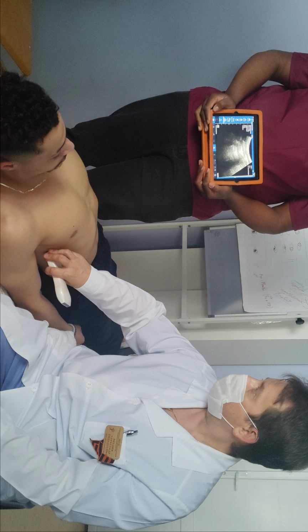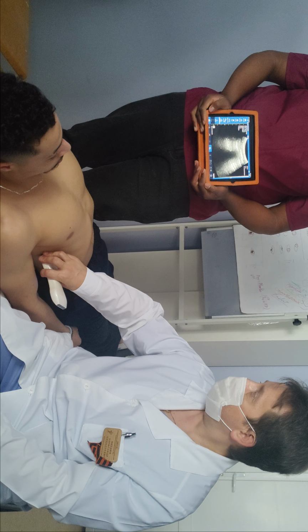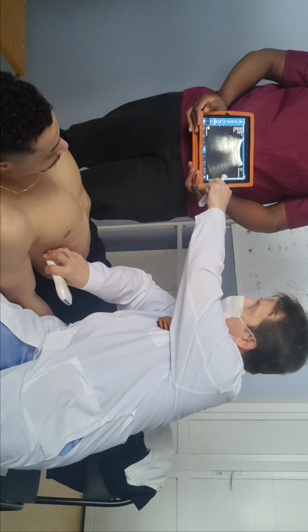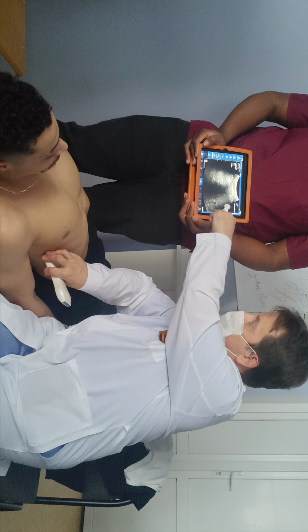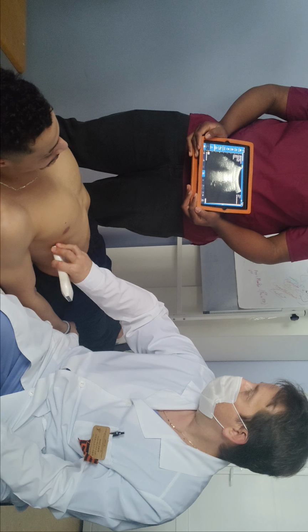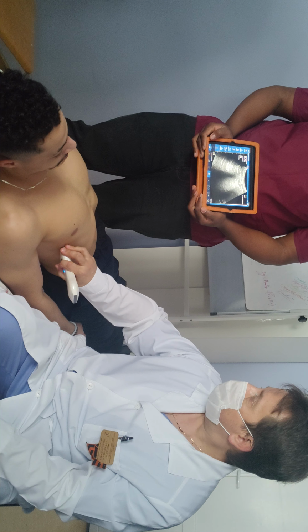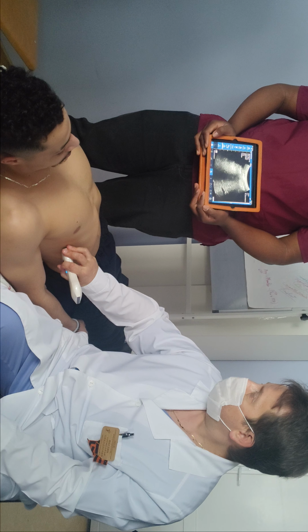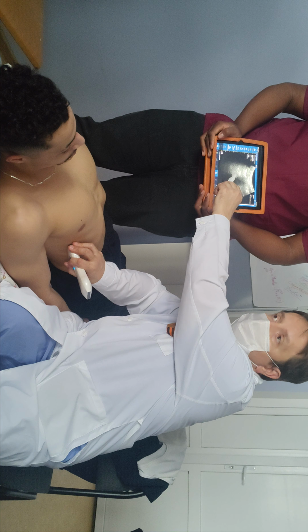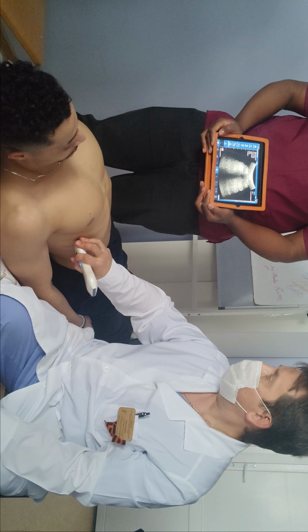Again, it is black, it is the ribs. It is a normal picture. Among the ribs we have some structures. For example, here we have a partial part of the spleen. Pardon, it's a hepatic zone. And what is interesting for us here is the placement when we have a hepatic picture. Look at this. Just nearby we have lung tissue. And if he takes a breath, make one. We have a touching point.